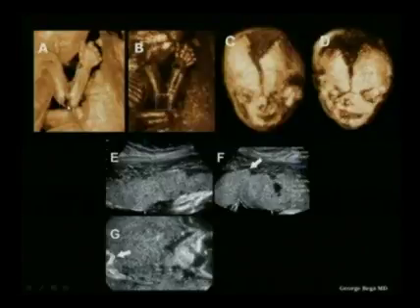The more you increase the threshold, it starts taking off not only low intensity echoes, but soft tissue as well. And so this may become a problem if you don't know it. This is an acquisition related artifact. What looks here in C like a narrowing of the metopic suture, normally a clinician would have to suspect craniosynostosis. In an additional volume, you see the metopic suture is normal, no problem.